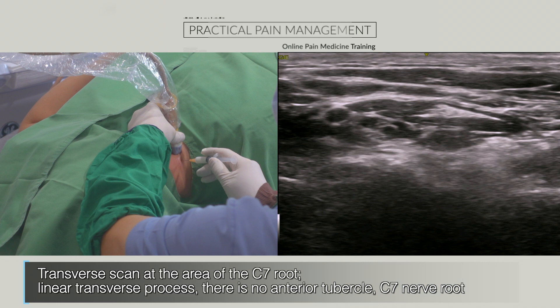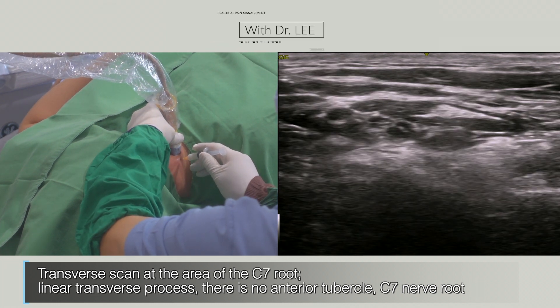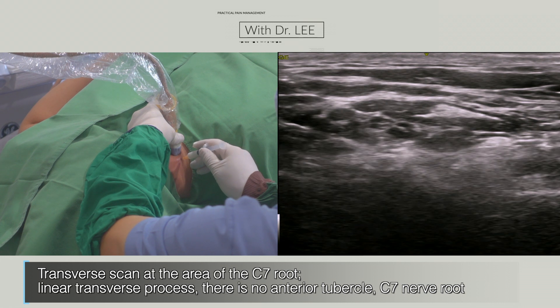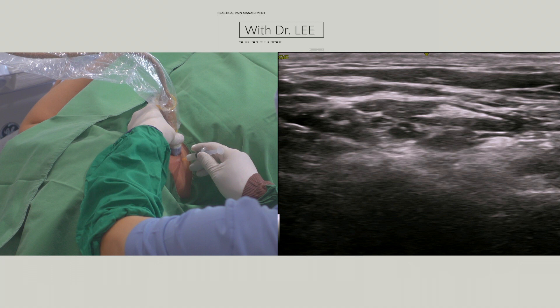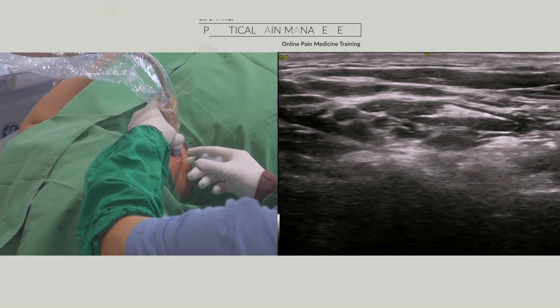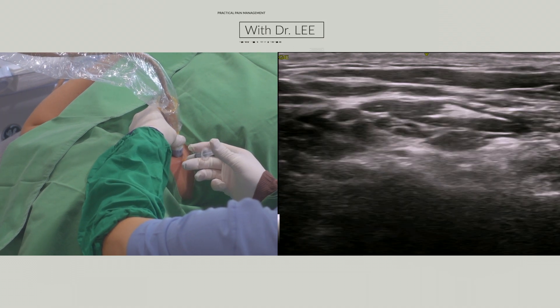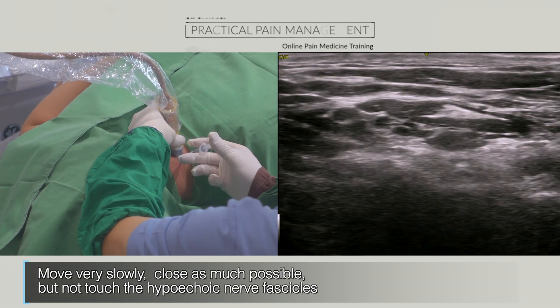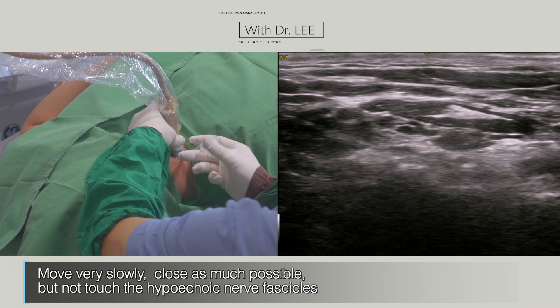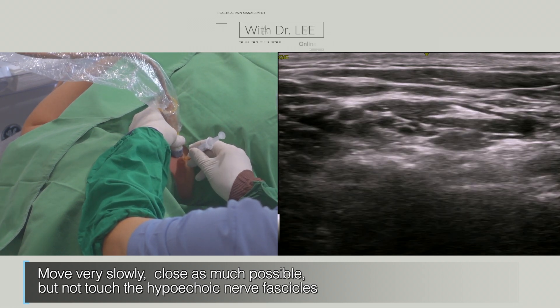This scan is a transverse scan at the area of the C7 root. The transverse process looks like a linear echogenic line and it has no anterior tubercle. I can find the C7 root medially. If my needle approaches close to the neural fascicle, I need to move very slowly. Frequently, I use the hydrodissection technique to separate the tissue and fascia.